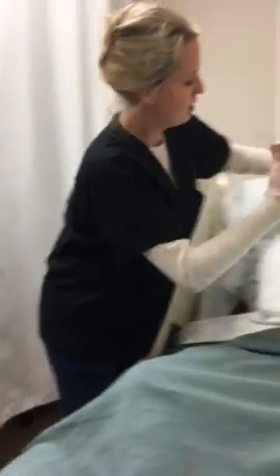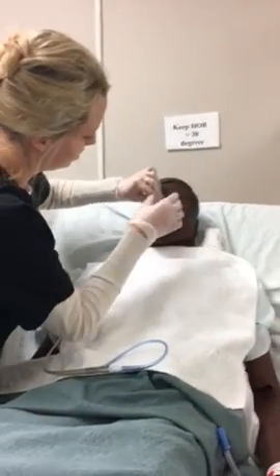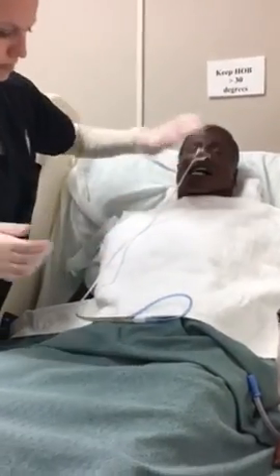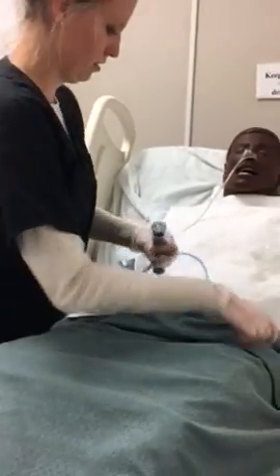And then I'm going to just secure this in place just temporarily until I verify placement. To do that, I'll take my syringe. Okay, that matches here on my chart.